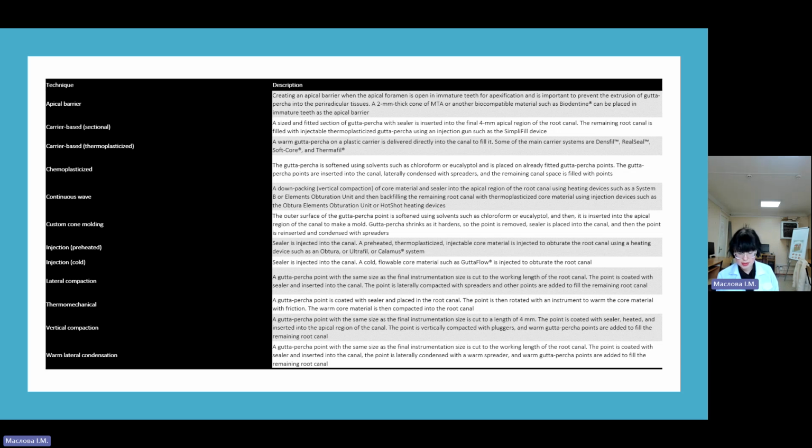It has been shown in vitro that it reacts with phosphate ions in physiologic fluid, resulting in the precipitation of hydroxyapatite. This is a similar interaction to that of bioactive glass. It is enhanced by the availability of phosphates in the canal, such as with a final phosphate-rich irrigating solution. This has been shown for a number of sealers when in contact with dentine.